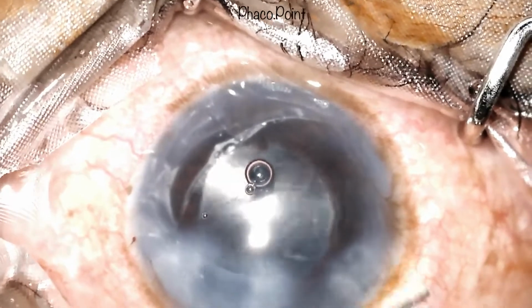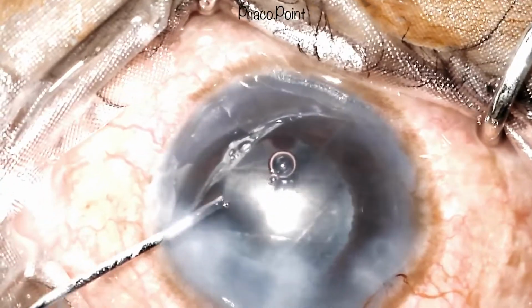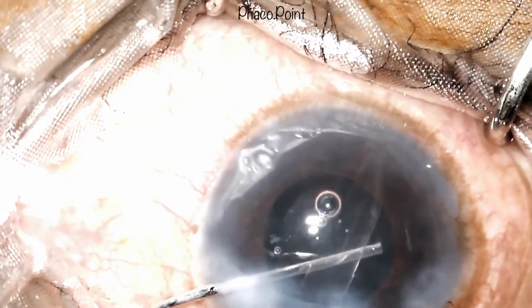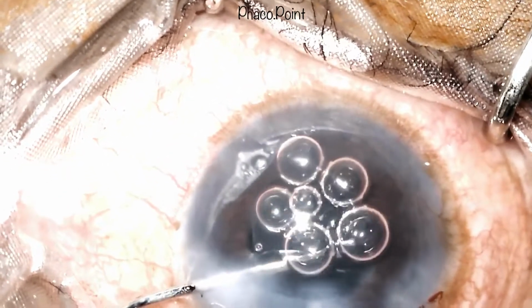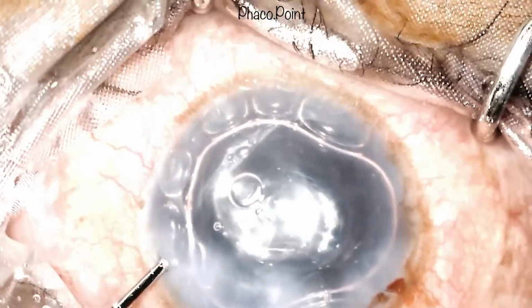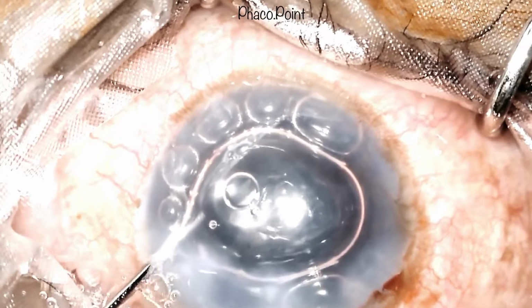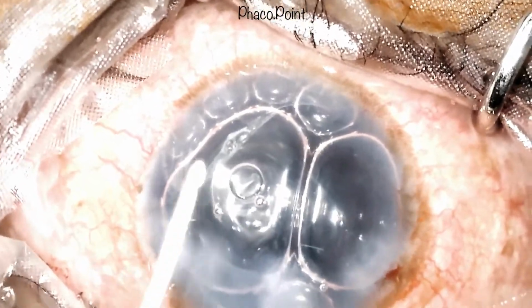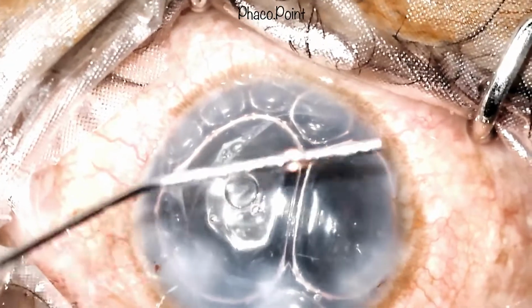Several attempts were made to try and unfurl the Descemet's scroll. The surgeon then finally injects a little air under the Descemet's membrane and fills up the anterior chamber. With the help of gentle manipulations over the surface, the surgeon is actually able to then open up the Descemet's scroll and flatten it against the underlying stroma.